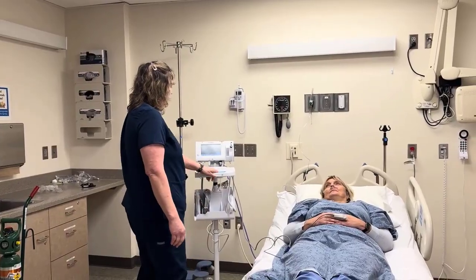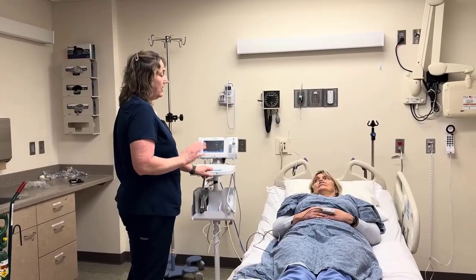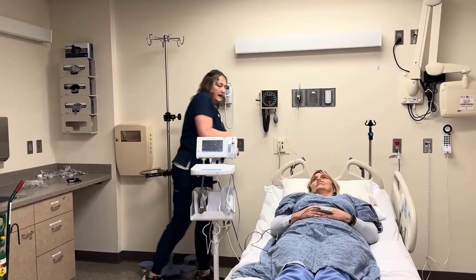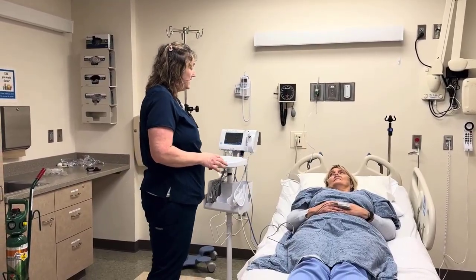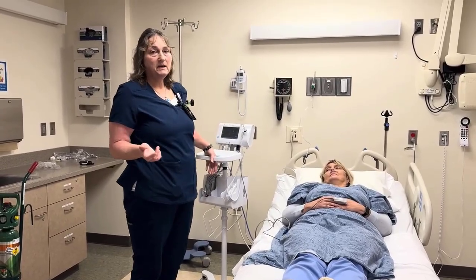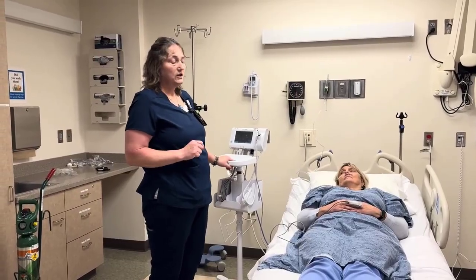So your oxygenation on your SAT monitor shows that your oxygenation on oxygen is fine. So what I'm going to do is I'm going to turn it off at the wall and I'm going to evaluate you closely to see, does your oxygen fall? So we're just going to wait here a minute, and this could be fast or slow. It all depends on the patient. Some patients will fall very fast, but I just want to make sure I monitor very closely.